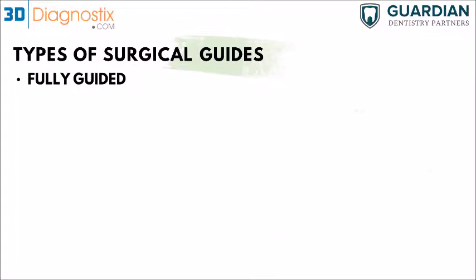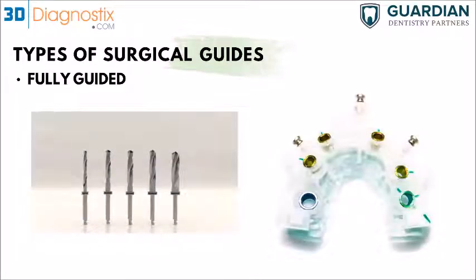And then the fully guided would be the opposite, of course. So everything from A to Z would be guided. You're going to seat the guide, drill the osteotomies through the metal sleeves, and then finally place the implants through those metal sleeves. So even the insertion of the implants and the timing of the connection would be guided.